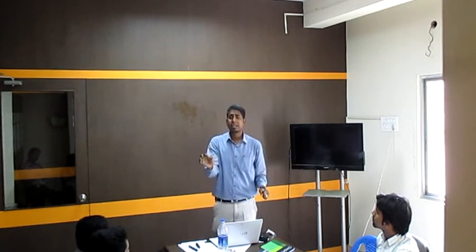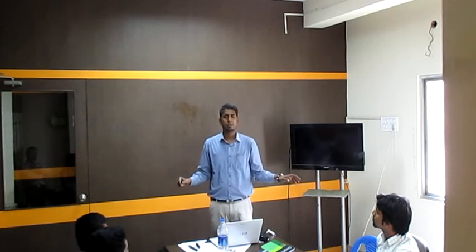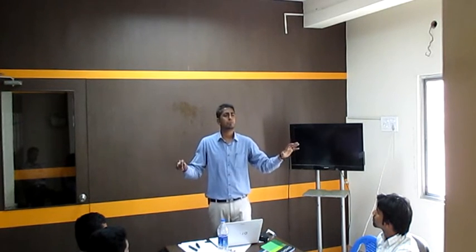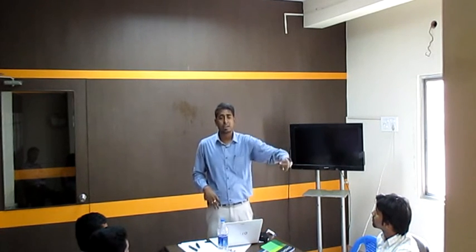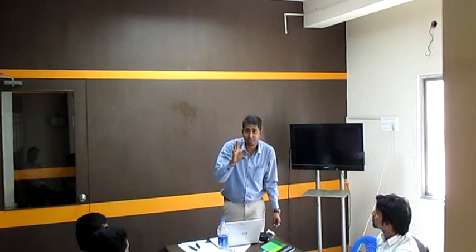That is the only sensation, because RCT, root canal treatment, is a complete blind procedure. The dentist is not seeing anything of what he or she is doing. Only one thing matters: your tactile sensation. You are just able to feel where you are working. That's all. So can you imagine how important this parameter is?